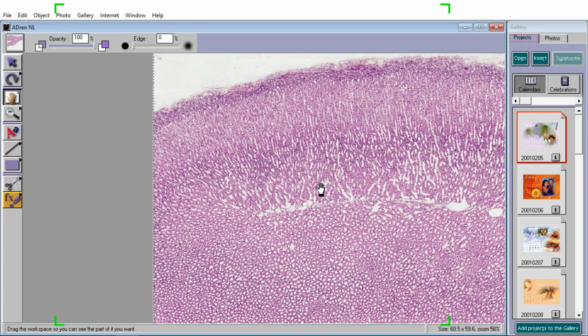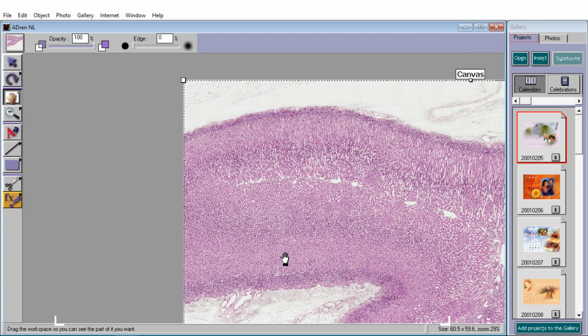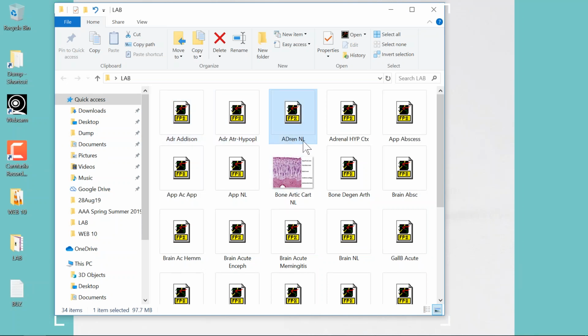Okay, so please, I'm going to pop this down a few more times. I want you to use your brain like a little iPhone camera right now, and I'm going to tell you this is a normal full thickness of an adrenal cortex and adrenal medulla. Okay, you don't have to learn the names of every one of those cells either. Just get a good picture for it. That's what I keep telling people in pathology. Don't get hung up on the names of the cells. Just get a good visual understanding, because this is about the most normal adrenal that you will ever see in your life. Okay, now that we had the normal adrenal, let's look at this now.